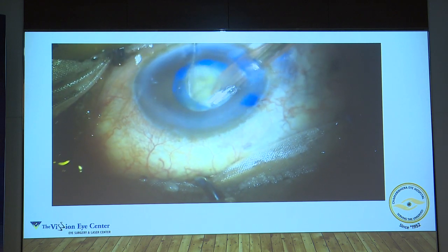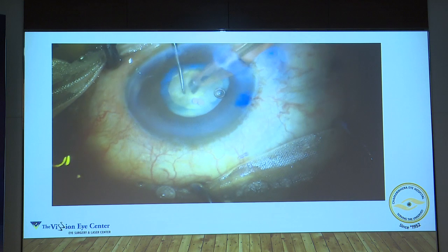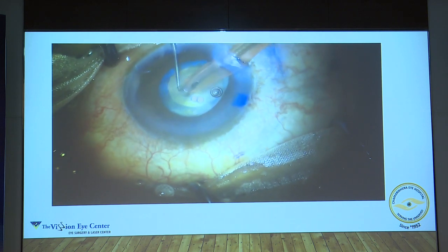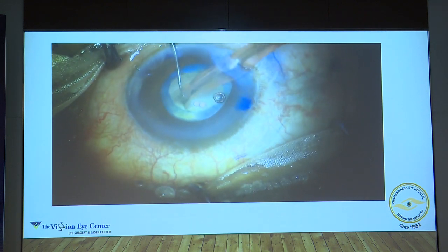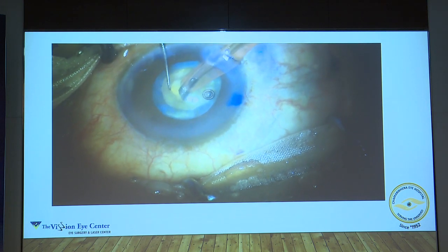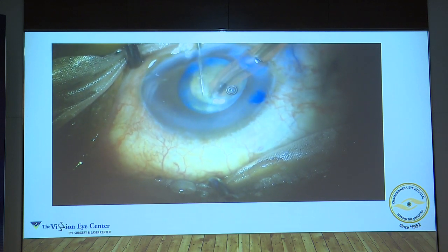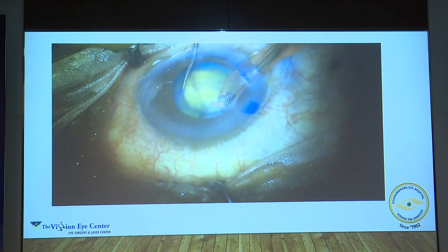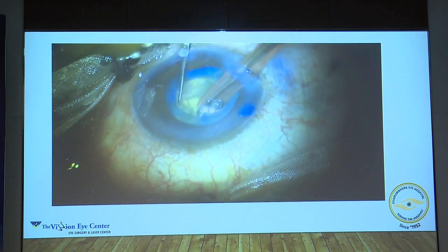Here again, you have to be patient. Keep trying until you receive a crack in the central core — the main part. The central core has to be cracked. Keep trenching until the center is cracked. There is a lot of tugging, but once you receive one crack, the rest of them become easier — it is the first one that is the most difficult. You can see a lot of fluid is escaping from the side port, so the chamber is shallowing. But we have got our crack now, finally. Once that is done, the rest becomes relatively easier. The center has to be cracked — that is the message.